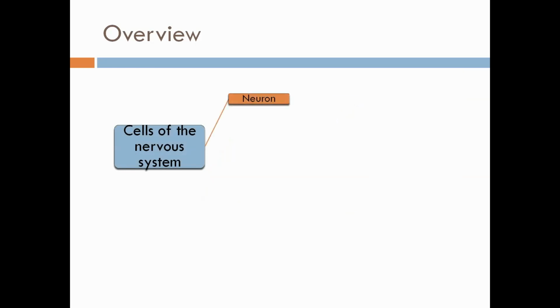The nervous system is comprised of cells that are the neurons and the neuroglia. The neurons are the basic structural and functional units of the nervous system. The neurons may be myelinated or unmyelinated, and based on their processes, they are either pseudo-unipolar, bipolar, or multipolar, in which case they again might belong to either the Golgi type 1 or the Golgi type 2 neurons.